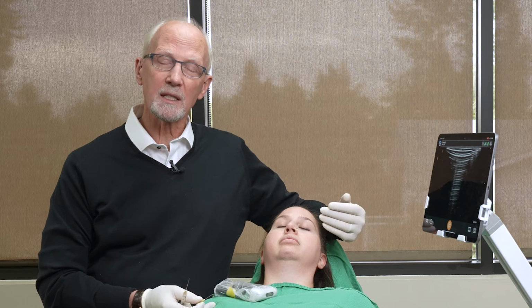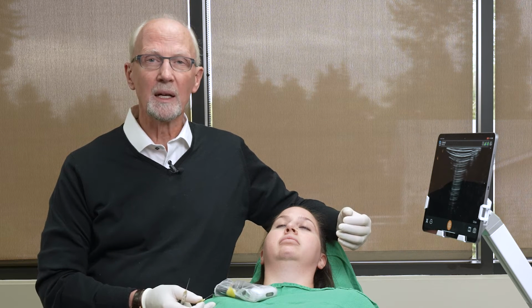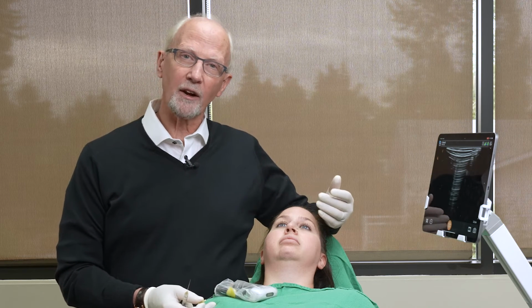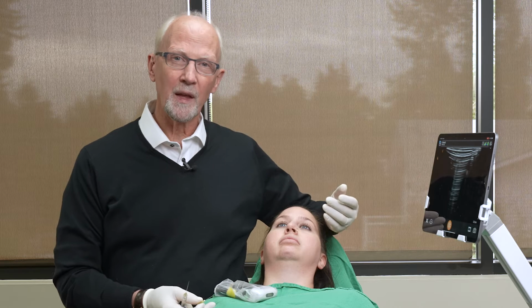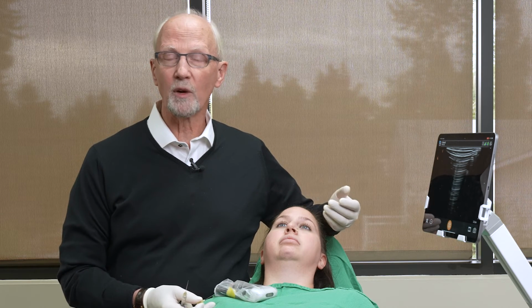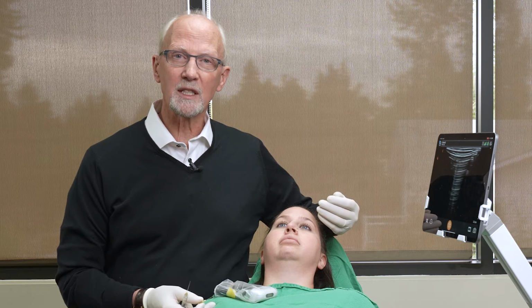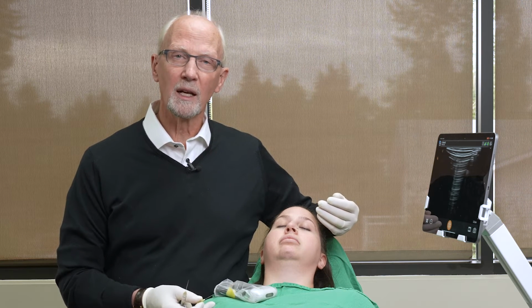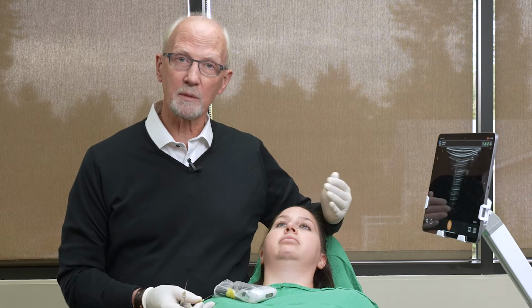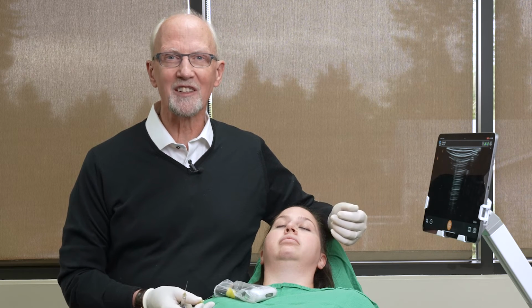So we'll see a distinct difference in terms of different areas where we're going to be able to see filler coming out. And then afterwards, we'll be looking at areas where we've placed filler in the skin, in particular when we're looking at re-draping the mandible and the jawline, so that you can see the areas where we've put product so that we can then fine-tune our results knowing on where we expect to put it and where in fact the product winds up after we had injected it.